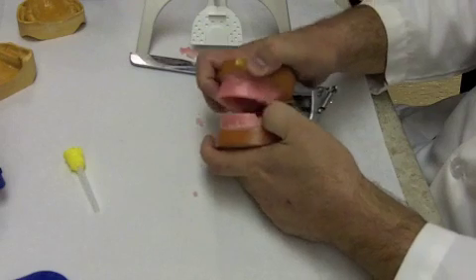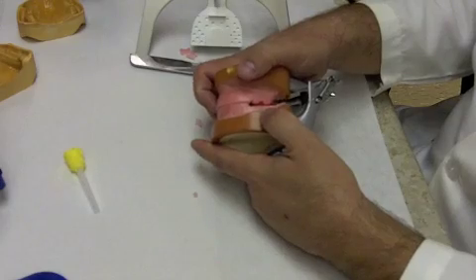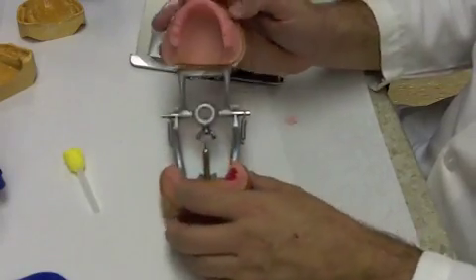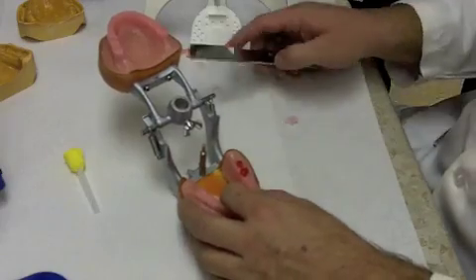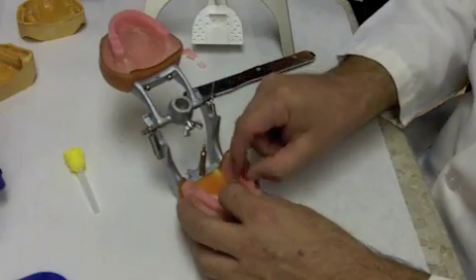Okay, so this is a time where it's good if you have applied a little Vaseline to the maxillary rim, because this will help the wax to not stick to the maxillary rim. Once we've gotten this on both sides, we feel confident as far as our vertical dimension of occlusion, then we are ready to take our centric relation record.